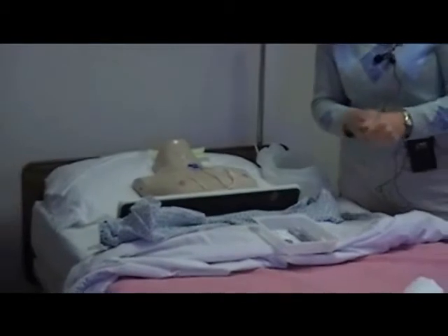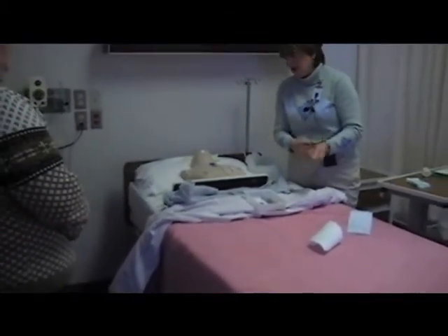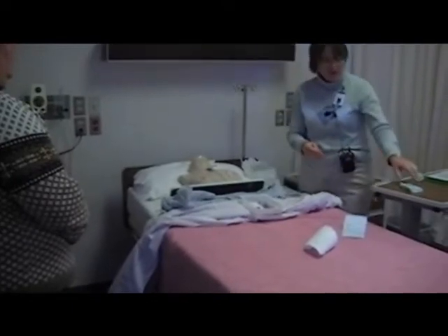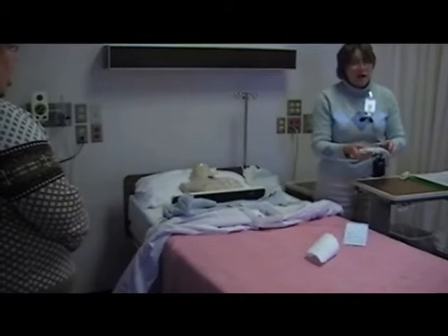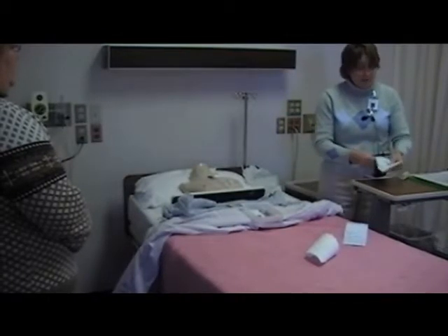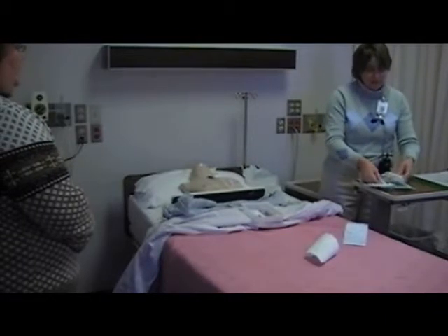Okay. I've talked to my patient. He says he's doing fine. The mask isn't bothering him at all. He feels good. So I'm going to put on my sterile gloves. Now remember, the gloves that did come in that package are sterile. So make sure you put them on, maintaining sterility.